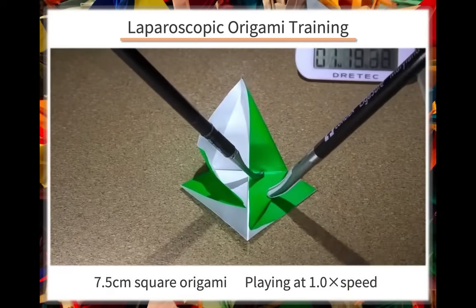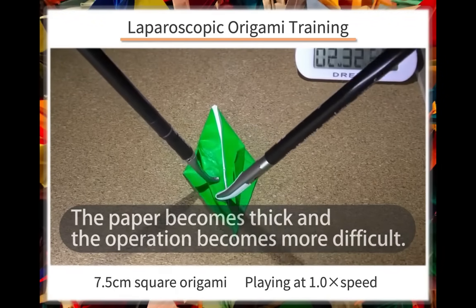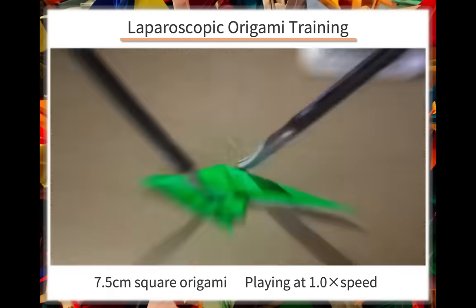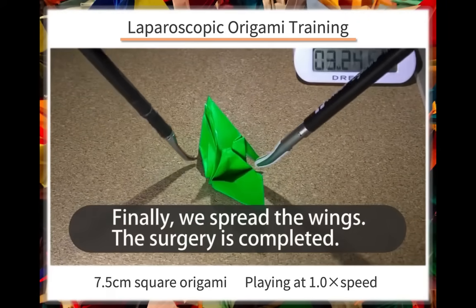As we go on, the paper gets thicker and the procedure becomes more difficult. Shaping the beak is the most difficult part because it requires close coordination between both hands. Finally, we spread the wings and finish.